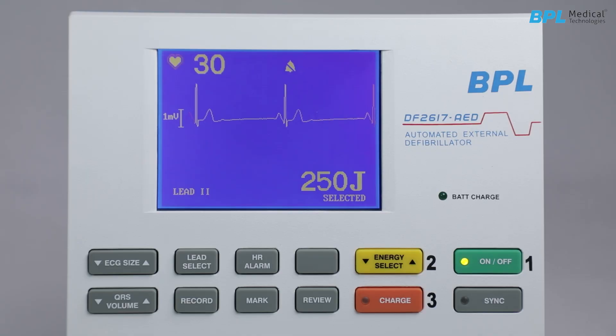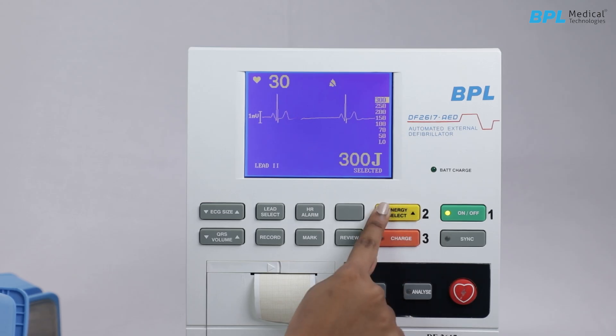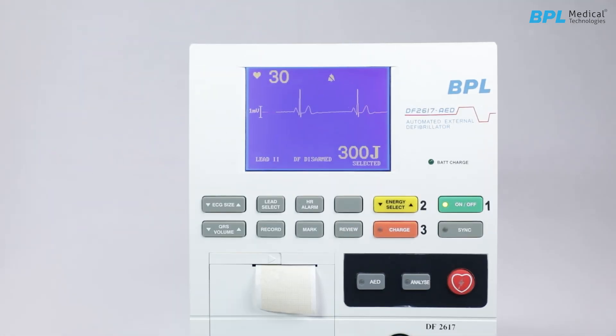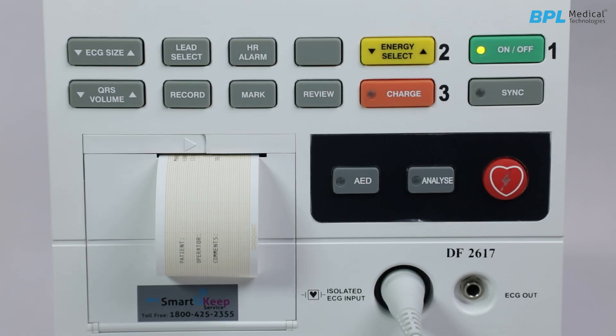To change or reset the selected energy level, press the energy select key twice. The device will disarm internally and a message 'DF disarm' will appear on the screen. Then select the new energy level and press charge. To print all events, press the key 10 seconds after the last event has occurred.